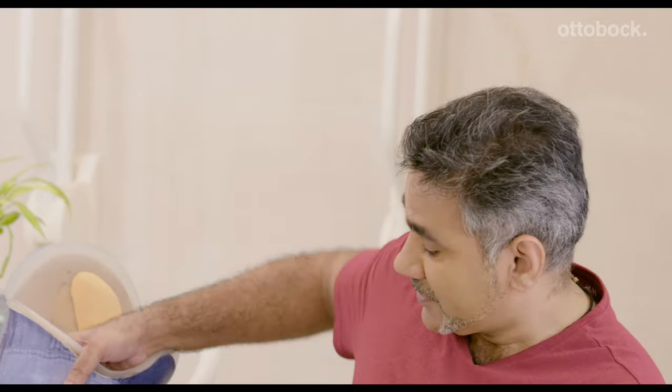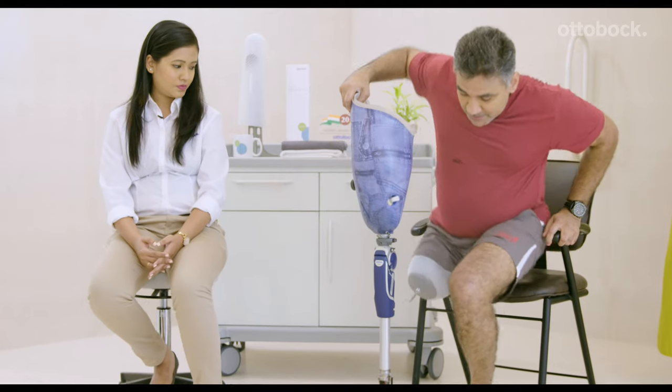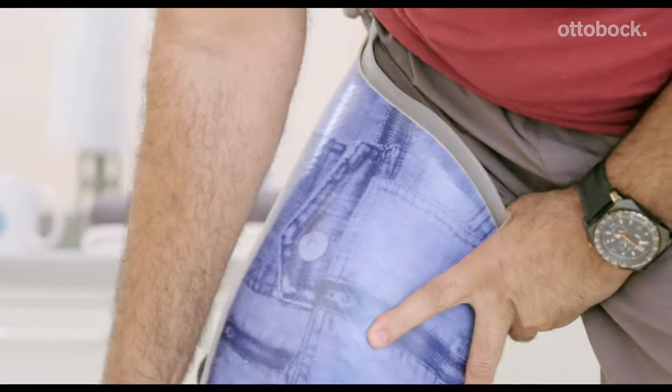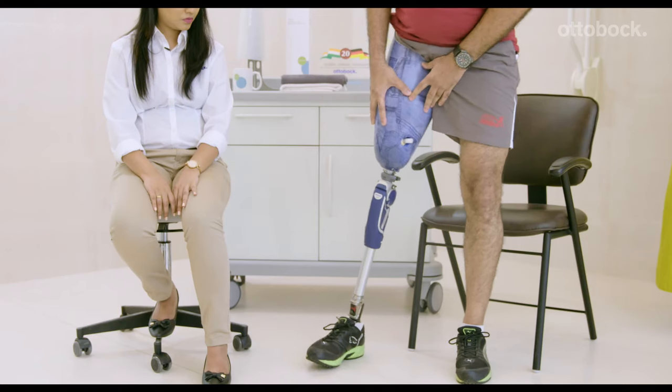Now onto your prosthesis. Your prosthetic foot is usually turned 5 degrees outside — this is a good reference point. Position your prosthetic foot and slide your residual limb into your socket and let the pin lock in its place.